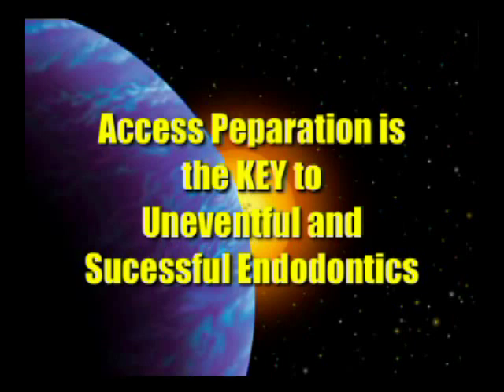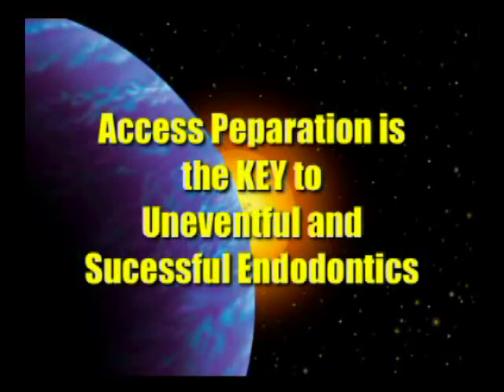Proper access preparation is the key to uneventful and successful endodontics. So today's tip is going to show you how you can minimize your access opening while making certain that you go straight into the canal. Unimpeded straight line access is going to be the key to proper preparation.